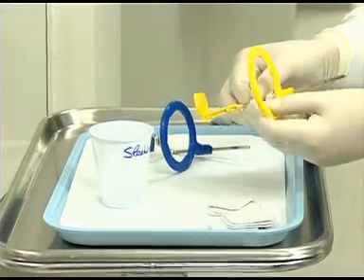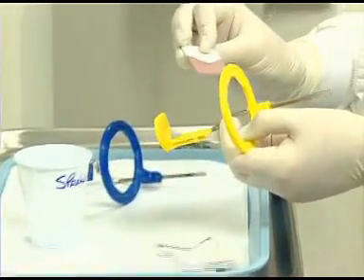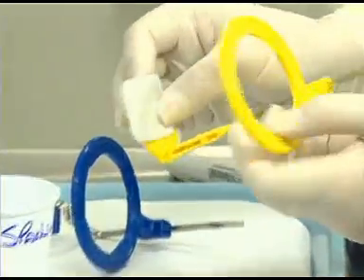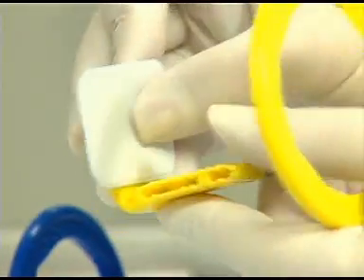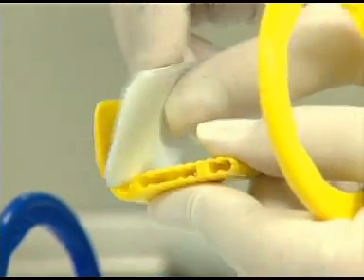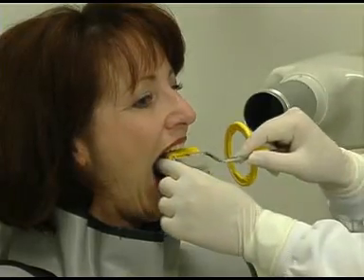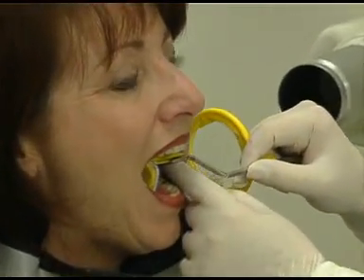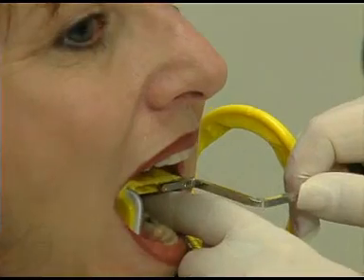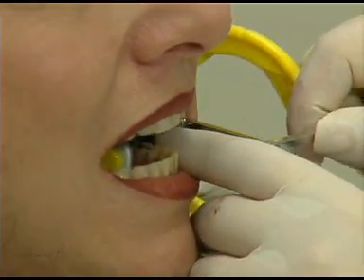For the mandibular molar region, insert the number two film horizontally into the posterior bite block. Center the film on the second molar and position the film as far lingual as the tongue will allow. This position will be closer to the teeth than that for the premolar and anterior views.